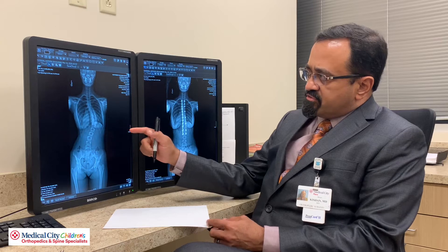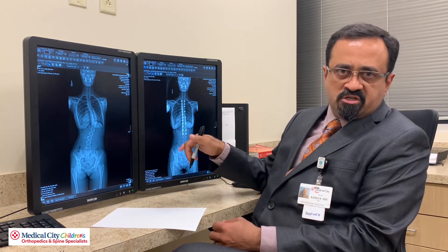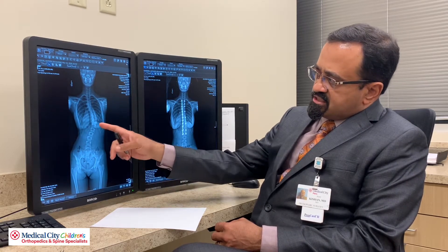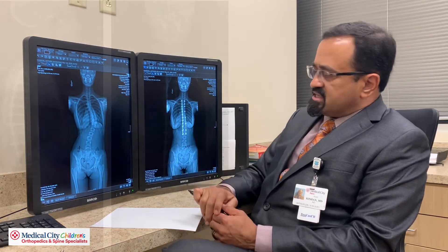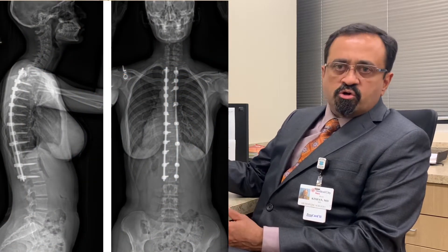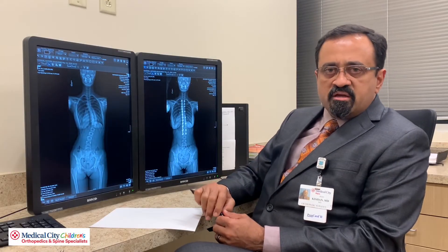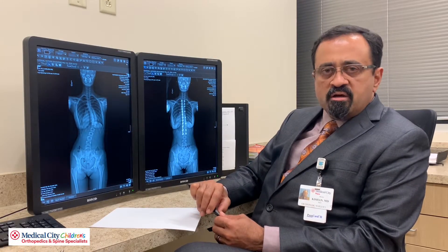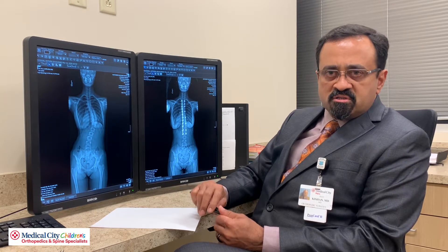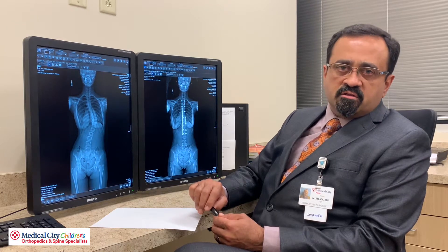Here you actually have a patient of mine who's had a standard fusion for scoliosis surgery. You can see that she had a fairly large right thoracic scoliosis, which has been nicely corrected, and this was done in a person who has already completed growth. So the role of vertebral body tethering is to operate at an earlier time in a child's life when there is ample growth still present, so as to use that growth and correct the deformity.